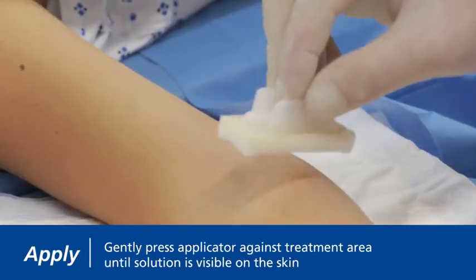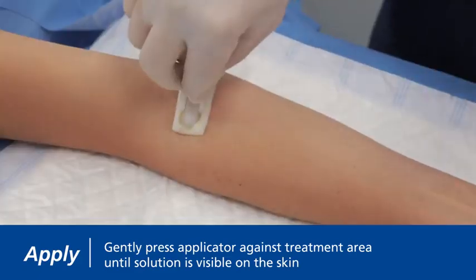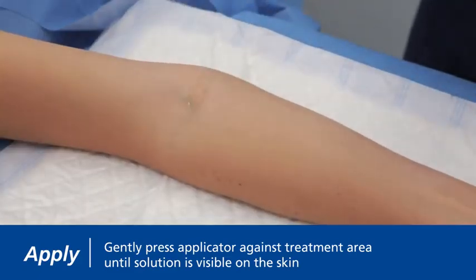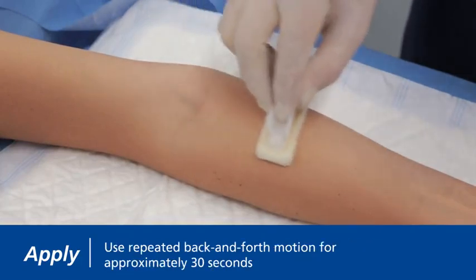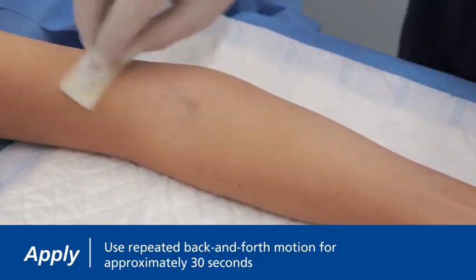Gently press the applicator against the treatment area to evenly distribute solution throughout the sponge until it is noticeably visible on the skin. Once solution is visible on the skin, use a repeated back and forth motion of the applicator for approximately 30 seconds.